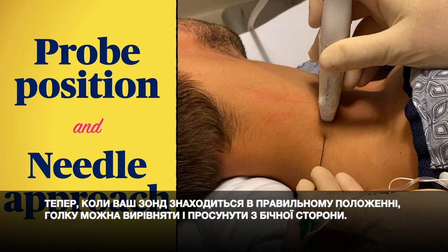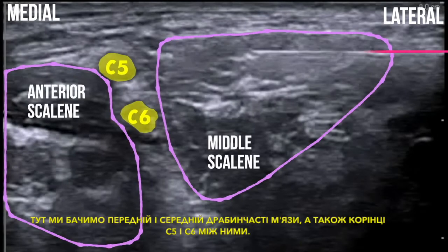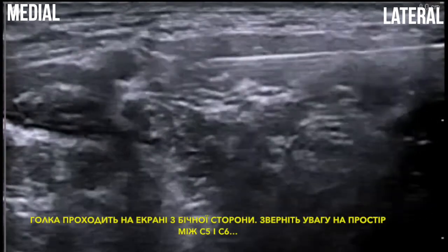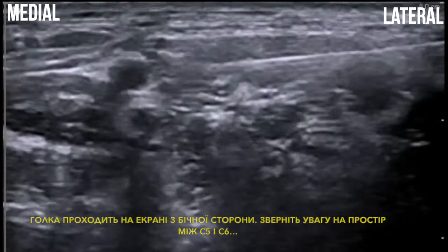Now that your probe is in the right position, the needle can be lined up and advanced from the lateral aspect. In real time here we see the anterior and middle scalene muscles and the C5 and C6 roots between them. The needle is coming across the screen from the lateral side. Note the space between C5 and C6 — this is a useful target to aim for.